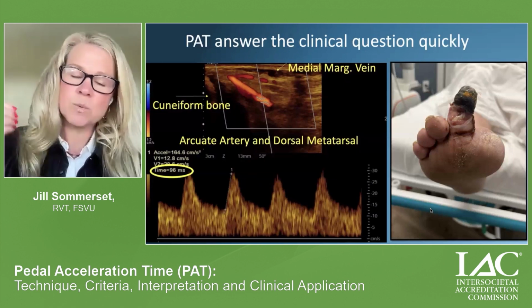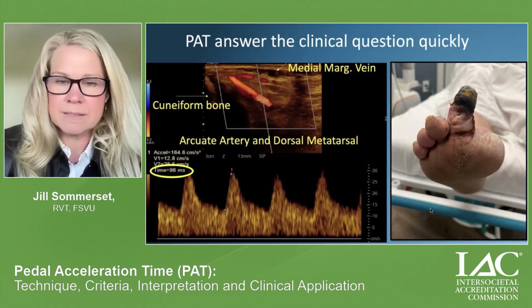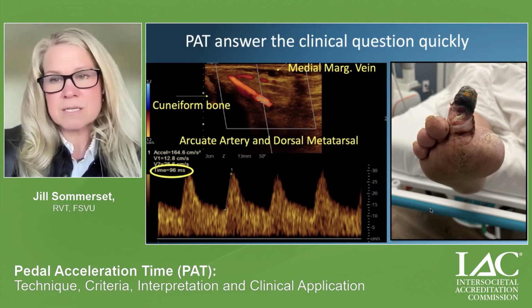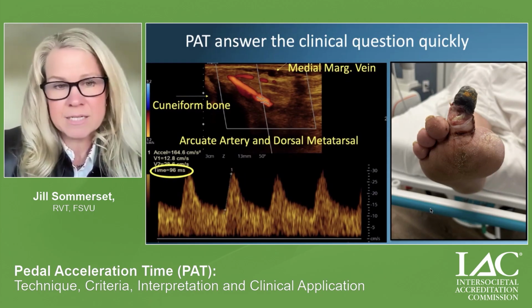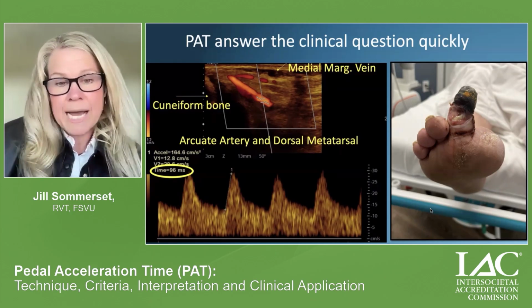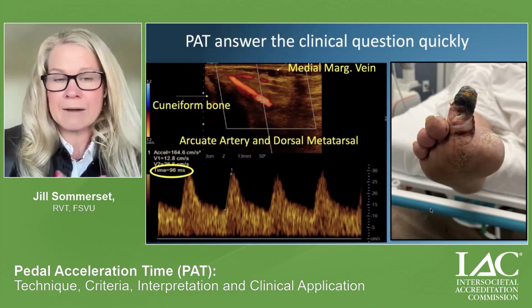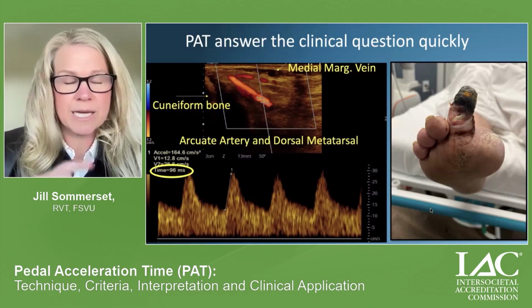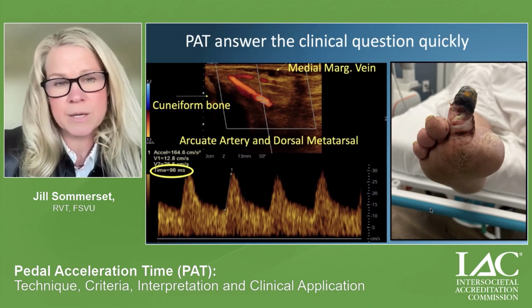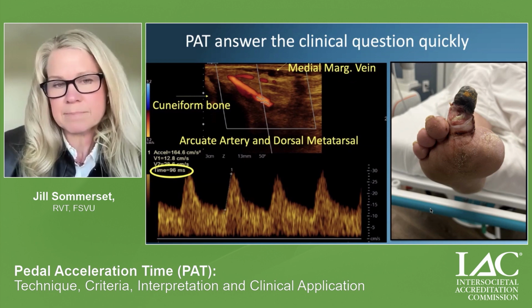And it's really nice because when you start at the wound bed, you can quickly evaluate, is the flow adequate or not? This patient has this infected second toe, and we need to know, can we amputate the toe? And does podiatry have the confidence to say, can we amputate the toe and the patient will be okay? Well, after vascular testing, this patient has class 1 PAT. They can do a second toe amputation, and the patient did really well, saving this patient from an unnecessary angiogram.